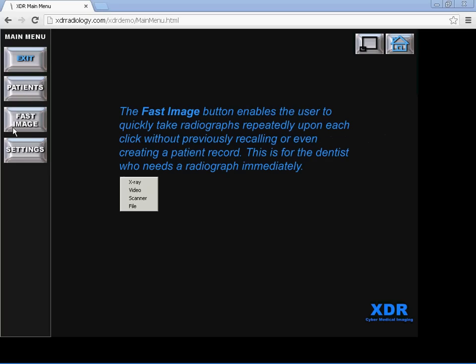There is the Fast Image button which enables the user to quickly take radiographs repeatedly upon each click without previously recalling or even creating a patient record. This is for the dentist who needs a radiograph immediately.